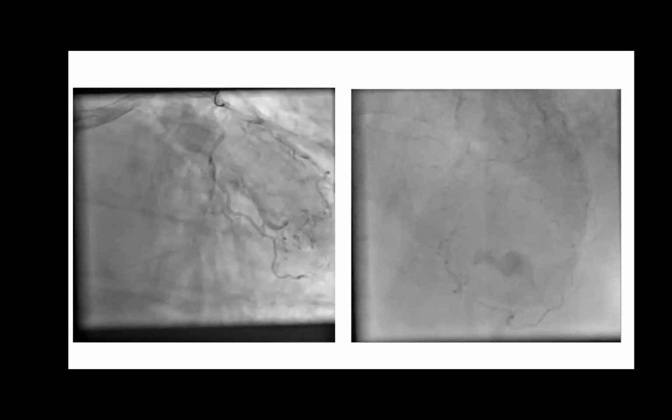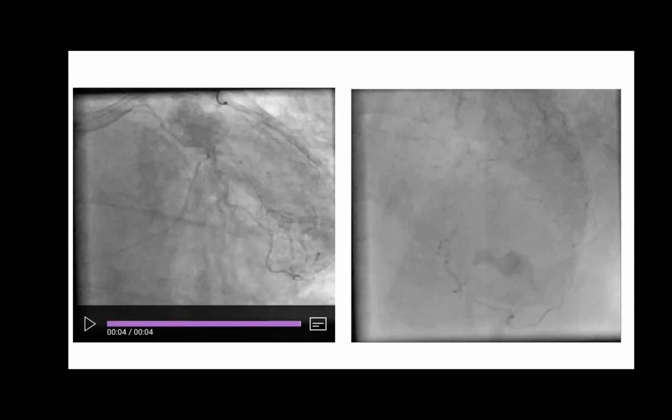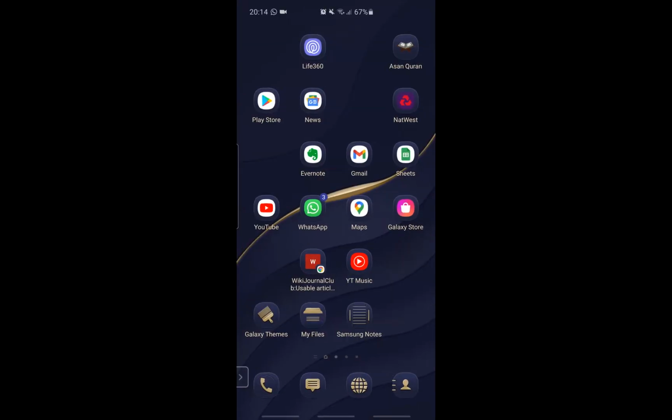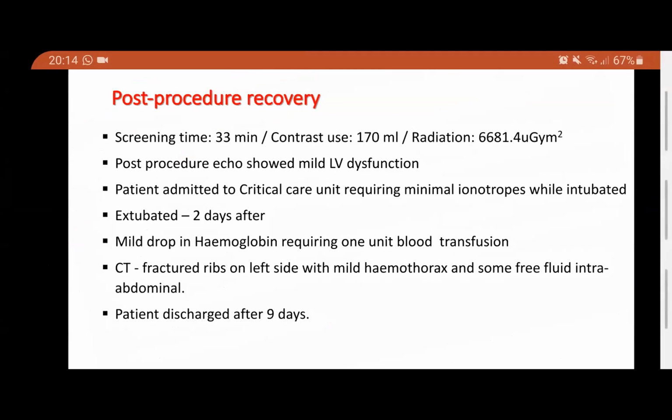And I think after that we sort of back stented into the left main. I think the left main stent was 5 millimeter in diameter, and then it was post dilated. I think the largest balloon we had was 5.5, and we just dilated it as much as we could. And once we sort of back stented it, the left circumflex luckily opened up by itself. You started stenting distally, isn't it?